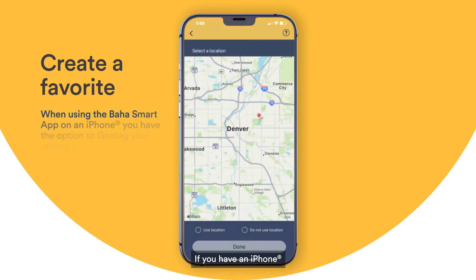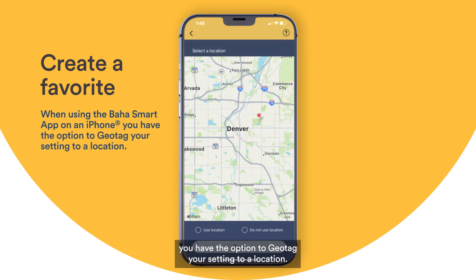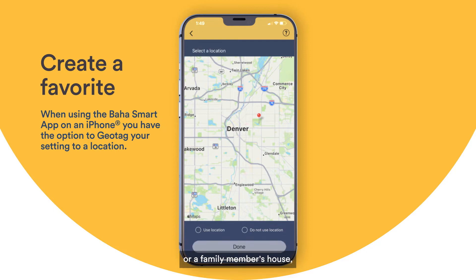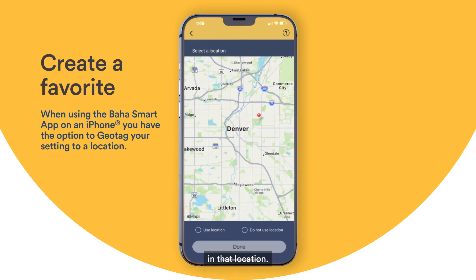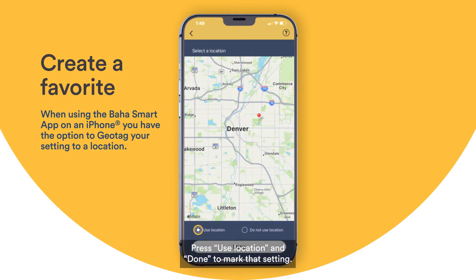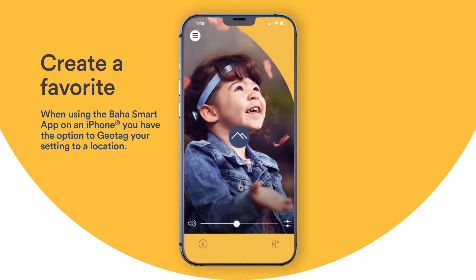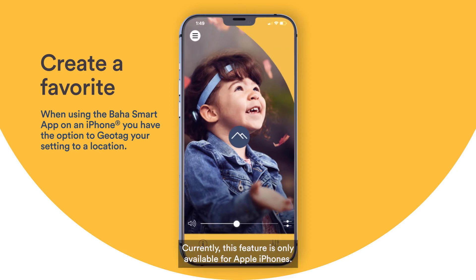If you have an iPhone, you have the option to geotag your setting to a location. This means if you frequently visit a cafe, hiking spot, or a family member's house, you can select that setting to automatically apply in that location. Press Use Location and Done to mark that setting. Currently, this feature is only available for Apple iPhones.